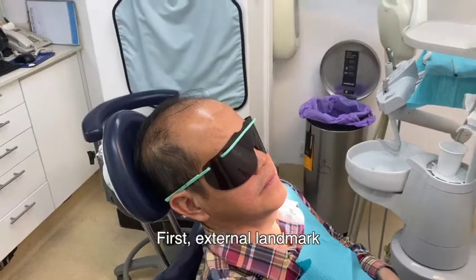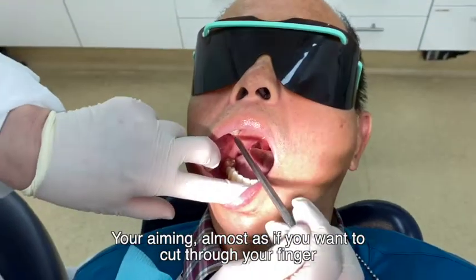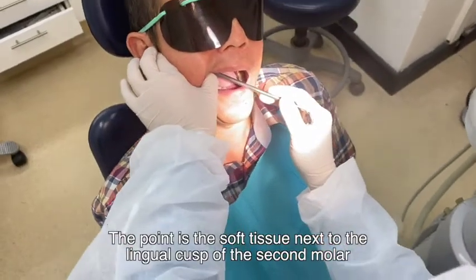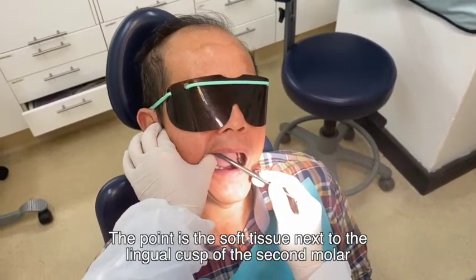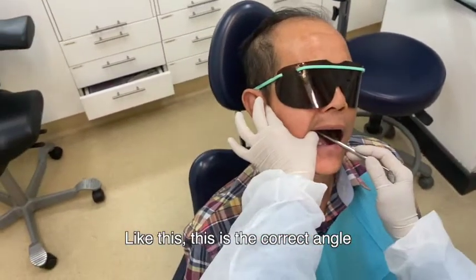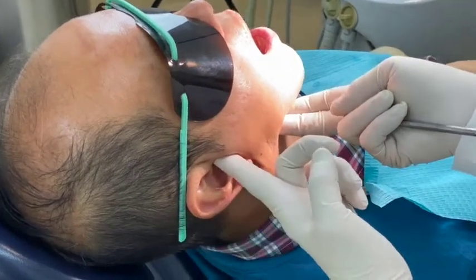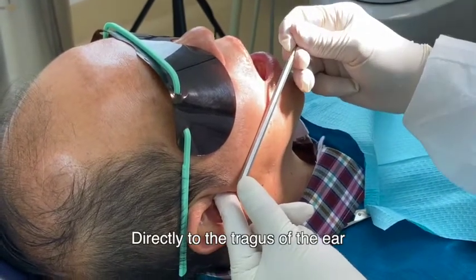First, external landmark. This is the condyle. So you inject from here. You're aiming almost as if you want to cut through your finger. The point is the soft tissue next to the lingual cusp of the second molar. Like this. This is the correct angle. This is the condyle, the tragus of the ear. This one, the commissure of the mouth, directly to the tragus of the ear.